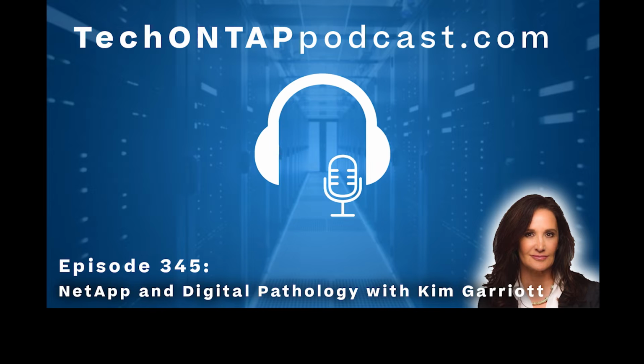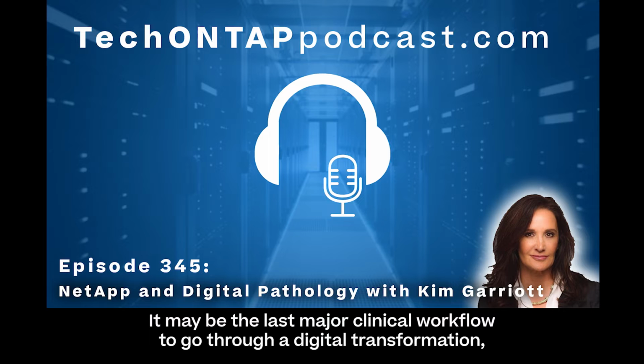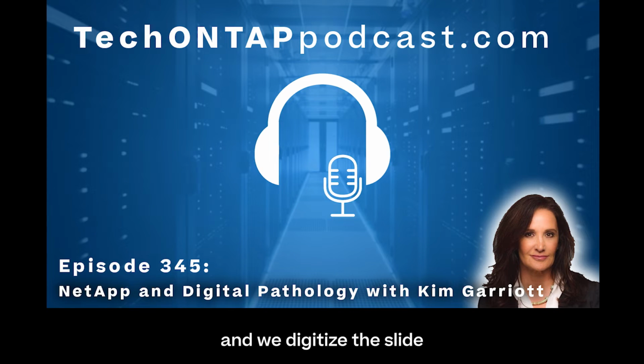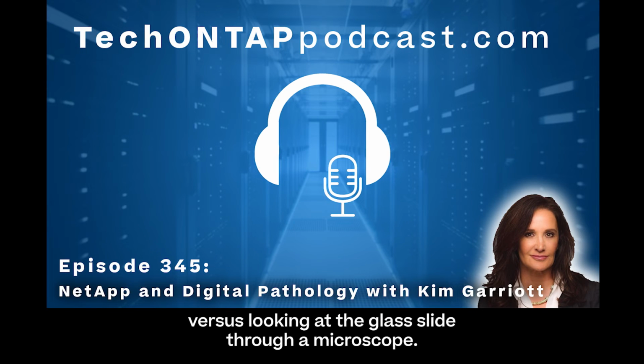So digital pathology is really the next digital frontier in clinical medicine, and maybe the last major clinical workflow to go through a digital transformation. That's when we take this glass slide and we digitize the slide so that the cells become an image, and then the pathologist can look at that through their computer versus looking at the glass slide through a microscope.